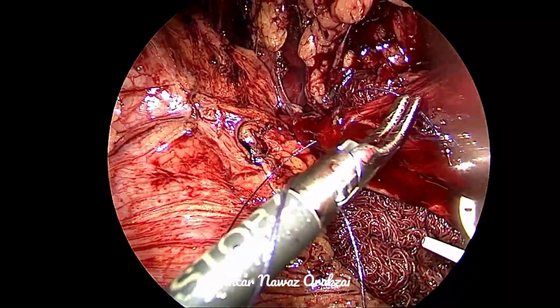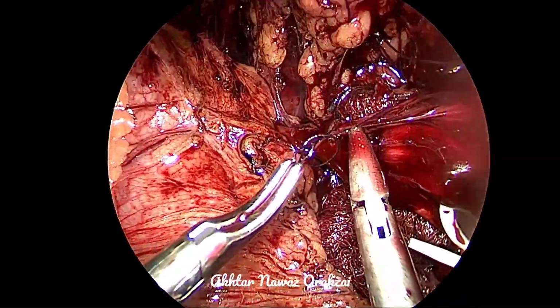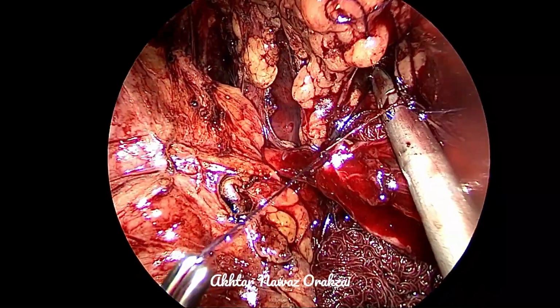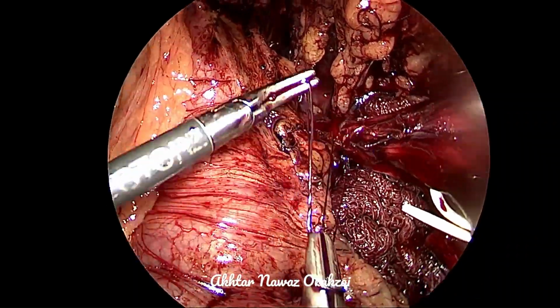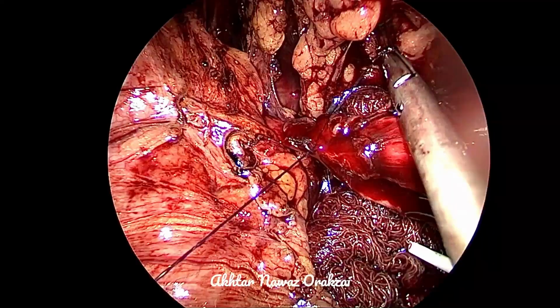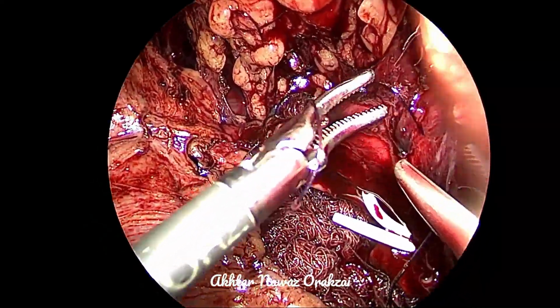The stitches in the corner are really very important, because they are going to decide the outcome of the pyeloplasty. So they have to be taken with good care. It doesn't matter whether you are performing a continuous suture or interrupted suture.